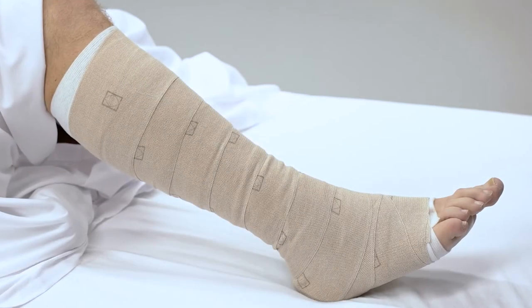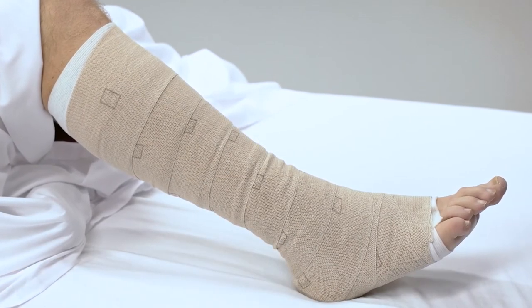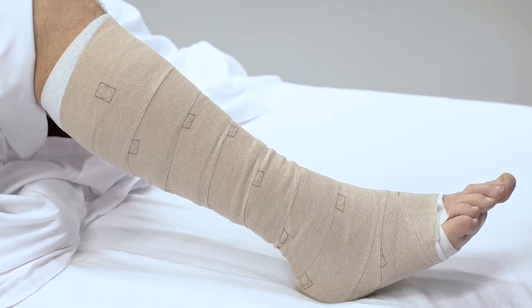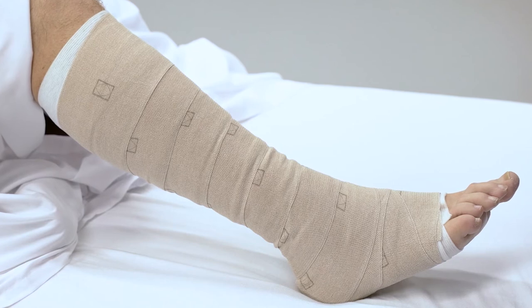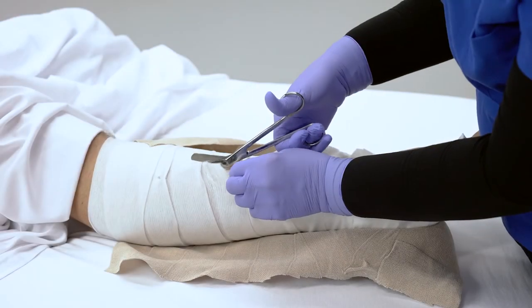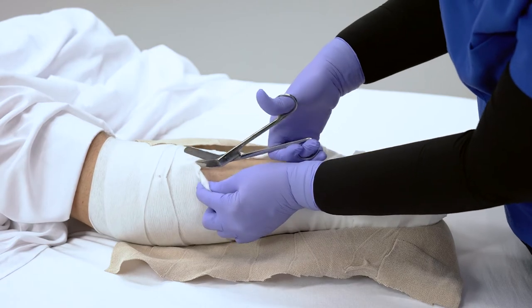ACCURAP can be left in place up to seven days and should be kept dry. The bandage may begin to slip or ride down due to the intended reduction in the edema or swelling of the leg. If this occurs, the bandage should be changed and replaced.